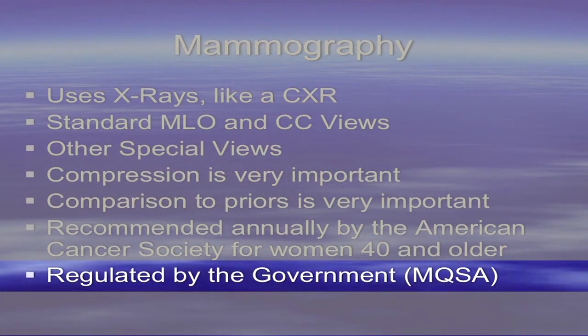And as you may or may not know, mammography is highly regulated by the government. They make sure the machines work properly. They're checked at least annually. The quality of the images is checked on a daily basis before any mammograms can even be performed. And this is the Mammography Quality Standards Act. So the credentials of who does the mammograms, the credentials of the technologists, the equipment, the screens that it's read on, and if it was filmed, making sure that the chemical reagents were all in the right balance before mammography can be performed.